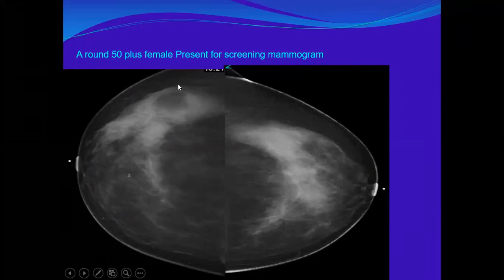You see, the patient was not cooperative. That is why her mammography was not an optimum one. I told you, she doesn't like to do that mammogram since the beginning. From the clinic, the physician was pushing her. And when she came, she was hesitating to do the study, and very uncooperative.